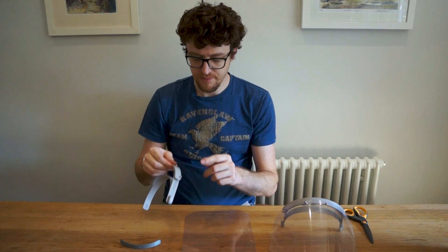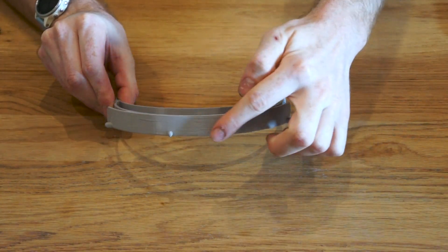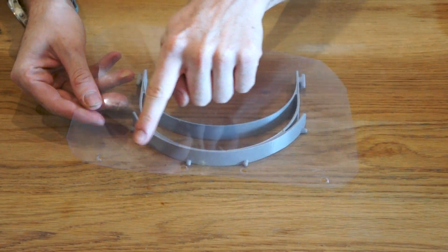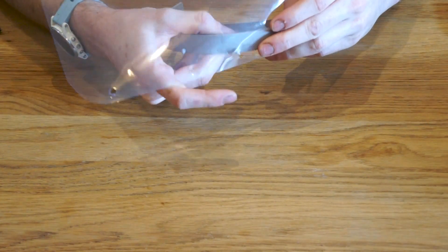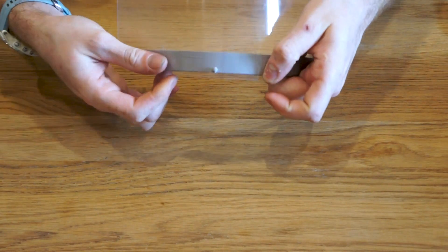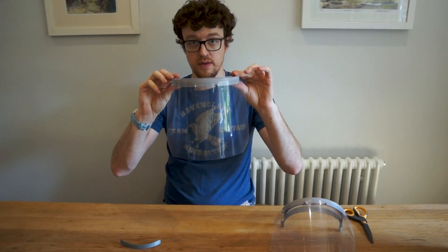The easiest way to start is to get the face shield part — you can see there are four pegs on the front of it sticking out, and they line up with the four holes on the shield part. Take one hole and one peg, line it up, then just work your way around the others, and snap it over the last one. And that's all on there.